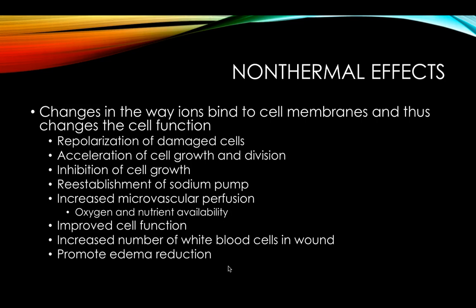Reestablishment of the sodium pump, increased microvascular perfusion, so that gives us more oxygen, more nutrient availability. Improved cell function, so injured cells have that reduced cell membrane potential, and that has been disrupting the cell function with an injured cell, and so that improves. We get an increased number of white blood cells, so the macrophages in the area, so that's going to improve tissue cleanup.